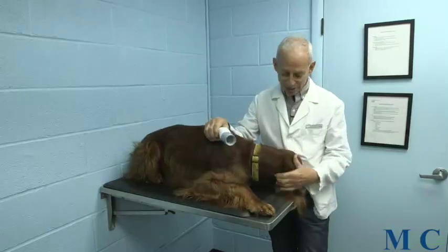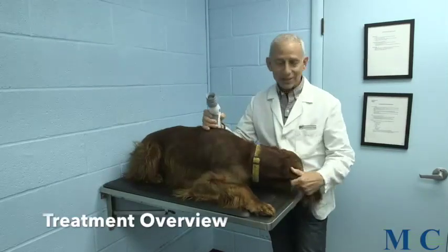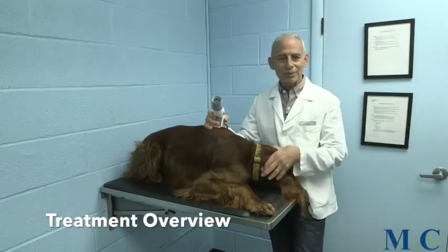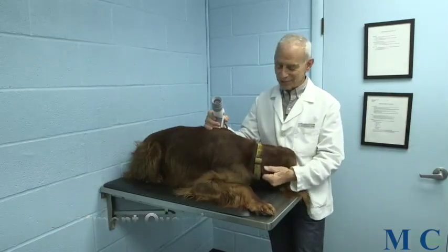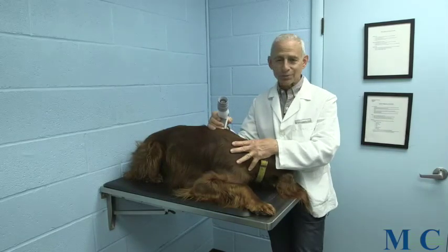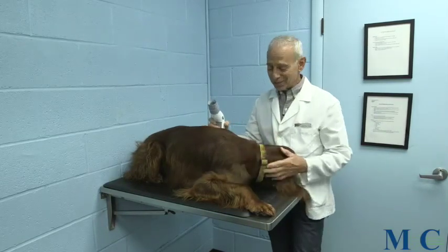This is Lou. Lou is a two-year-old Irish setter who fortunately does not have that many problems at this point in time, but given his activity I'm sure he'll be a patient in the not-too-far future. Lou is a great demo dog — first of all he's cooperative, and also with his long legs it makes it easier to point things out.